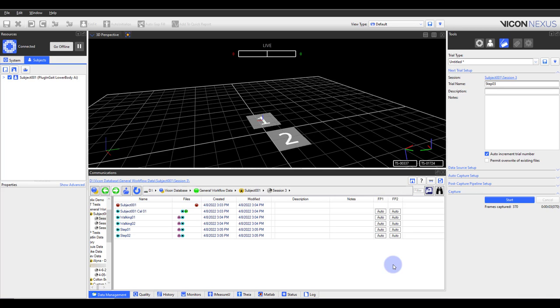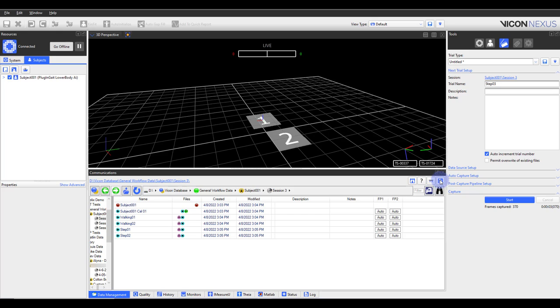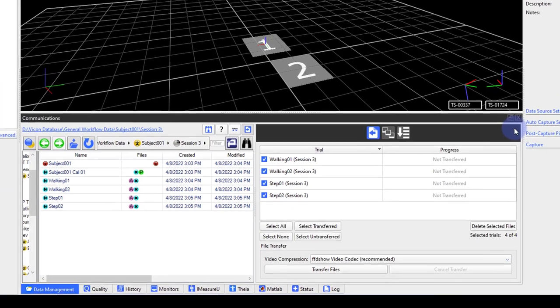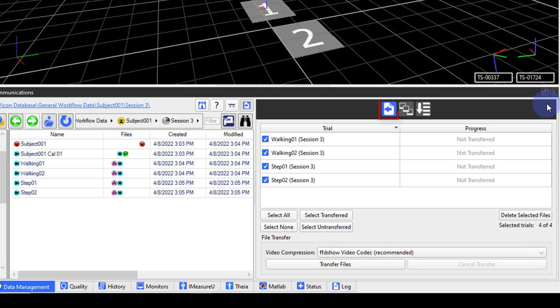Because problems can arise if trials or folders are renamed and the video drive can quickly run out of space, it is best practice to transfer your video files immediately after a collection. Once data collection is complete, I will navigate to the file transfer batch processing interface and select the file transfer tab.